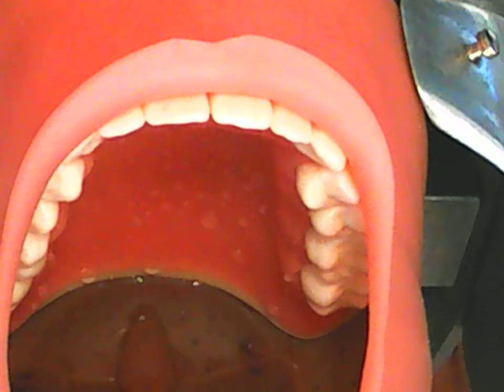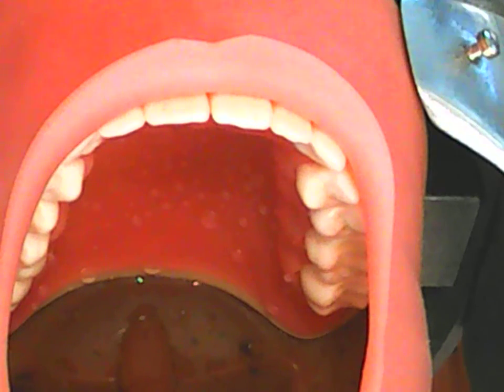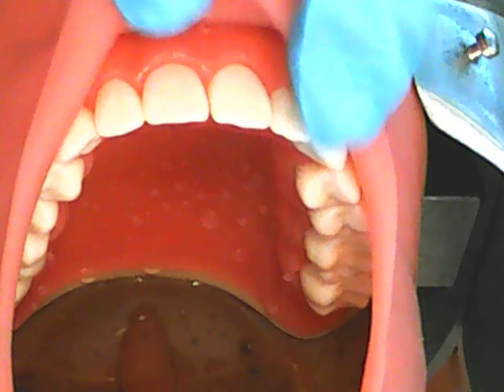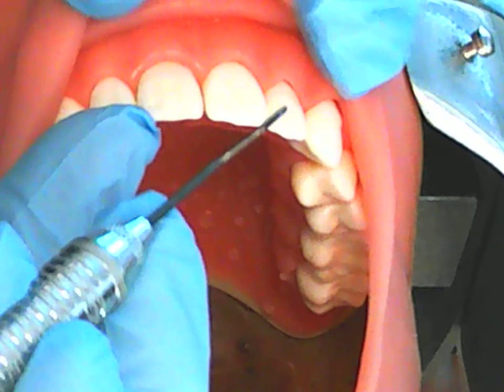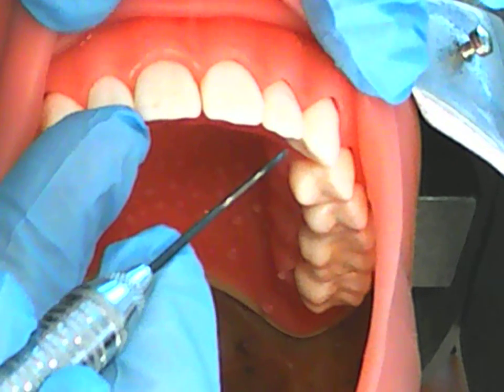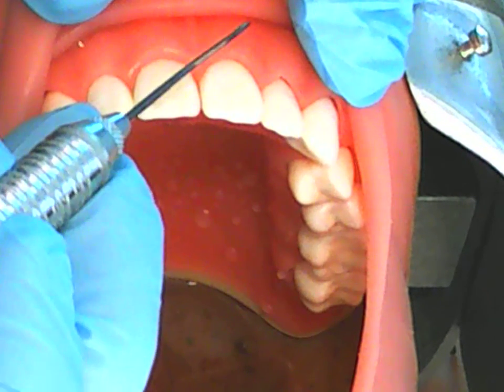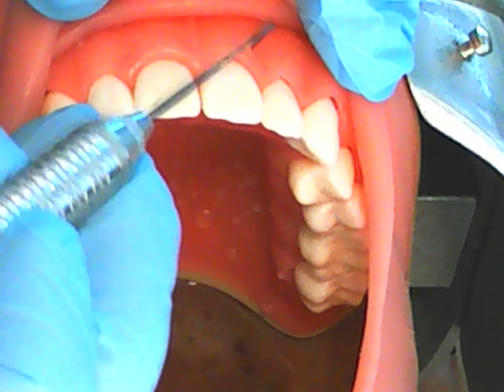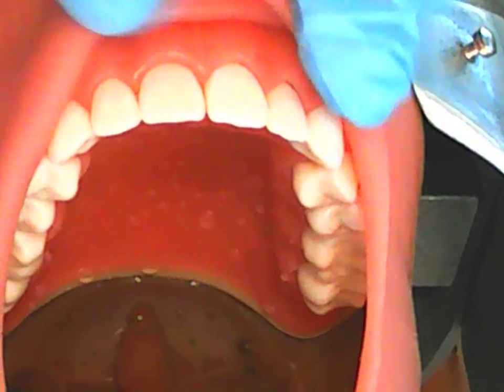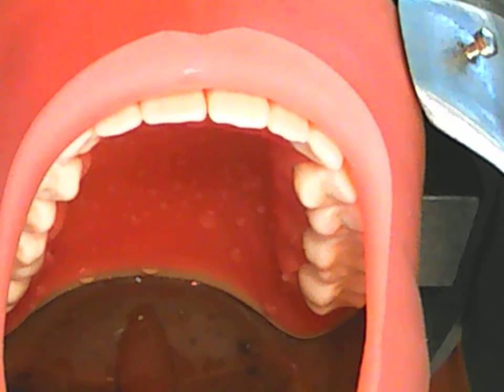Okay, so at this point you want to ensure effectiveness of your local anesthesia. We're going to say that the 2-1 is the tooth we're going to be working on today. So I'm just retracting the lip with my fingers, using a fulcrum with the explorer, and tapping lightly on the tissue. Does that feel all right? If the client is comfortable, then you have attained effective local anesthesia.